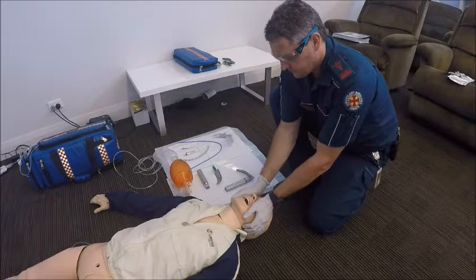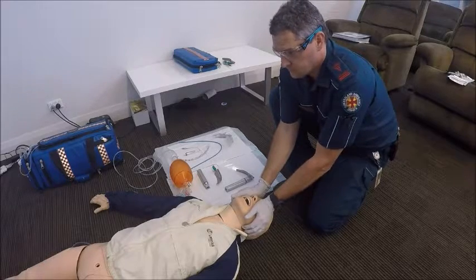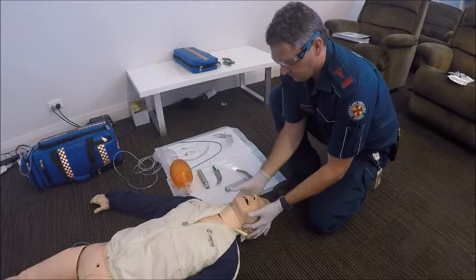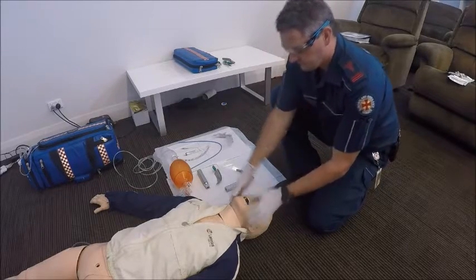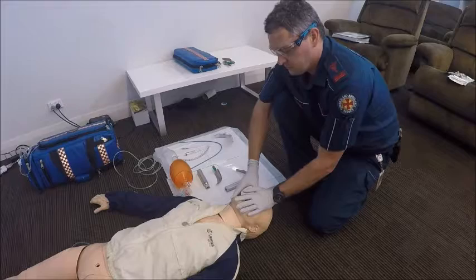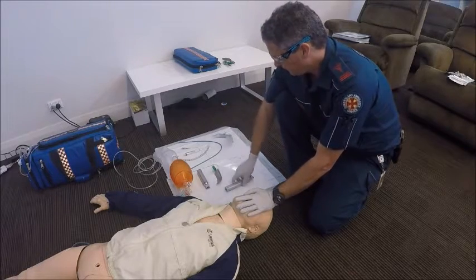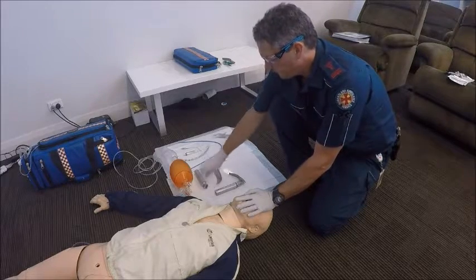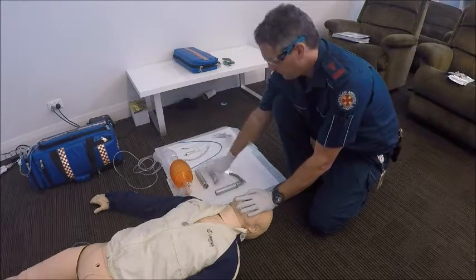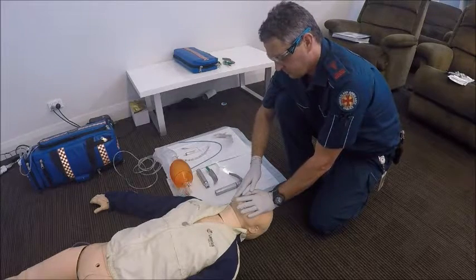In pre-hospital environments, most laryngoscopy and intubation will happen either on the ground or on the stretcher in the back of an ambulance. If there's no cervical considerations, we place the patient in the sniffing position and pre-oxygenate with the bag valve mask to ensure maximum oxygen reserve. Have a laryngoscope with the appropriate size blade, a spare laryngoscope blade one size smaller, a spare handle with a working light, and our intubation equipment prepared and ready to go.